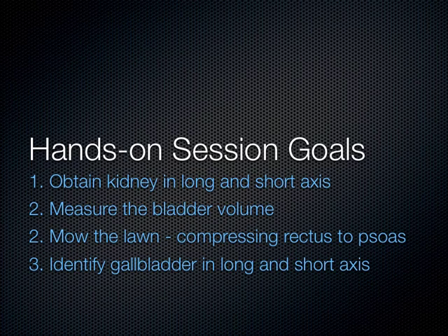It does something too with the lateral abdominal wall muscles maybe, brings those in a little bit tighter so you can use them for compressibility. Brings the contents of the abdominal cavity, the intestines, a little bit more anterior, so you're compressing anteriorly and not laterally, coming from the side. That's the only thing I can think of. I get that question all the time, and that's how I think of it. It just brings everything a little bit more together, a little tighter into the abdominal compartment.